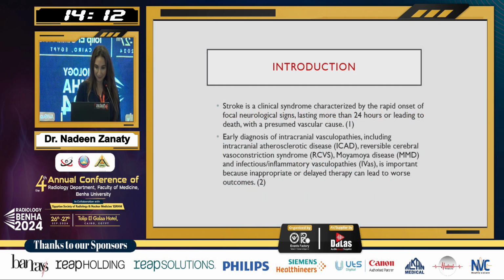First, well, as Professor Dr. Ahmed Farid said, when we talk about the intracranial vessels, all we have is luminal imaging, and actually that's not totally accurate, because funnily enough the pathology is in the vessel wall itself. Luminal imaging, digital subtraction angiography, and other tests can't usually allow us to see what happens in the wall itself. But thanks to this new emerging technique, we can see the pathology of these different diseases.